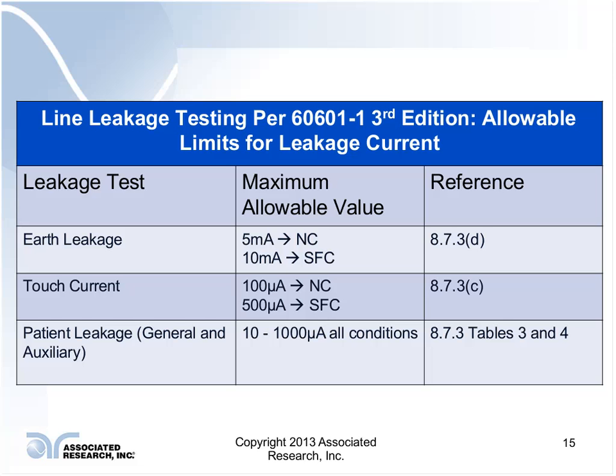So that's pretty much your top of the bar leakage current limit for this standard when you're doing a leakage test. For touch current, it's a little different. Now the values are lowered because we're talking basically with touch current, we're talking about, let's just say, a chassis point on your medical device.